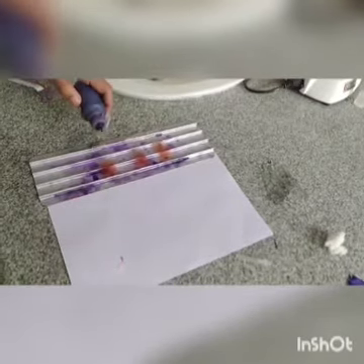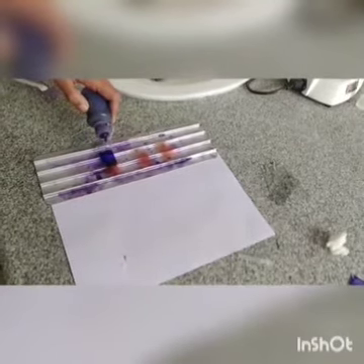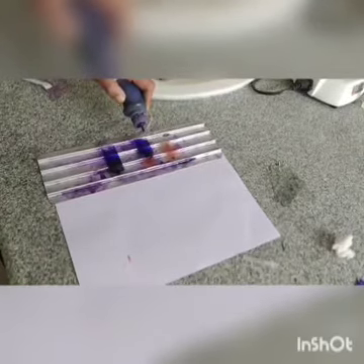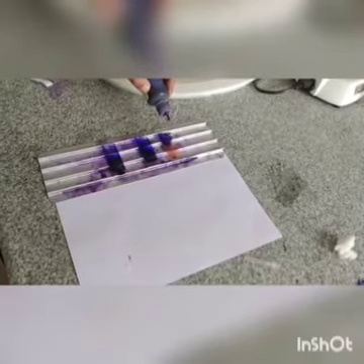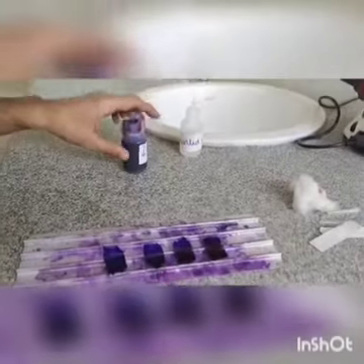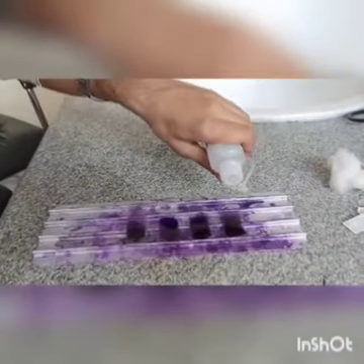Our slides are completely dry. Put the drop of the Leishman stain to cover the entire surface, and the stain should be added from the side to cover the smear. And wait for 2 minutes. Add distilled water, double the amount of the Leishman stain.